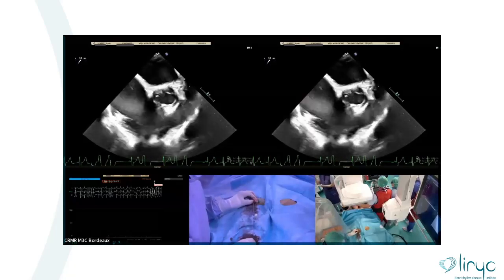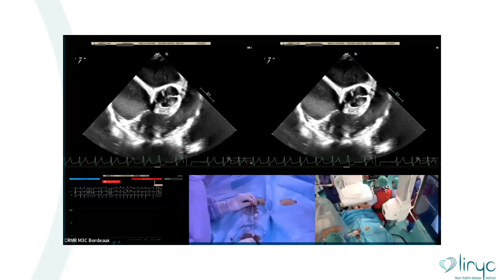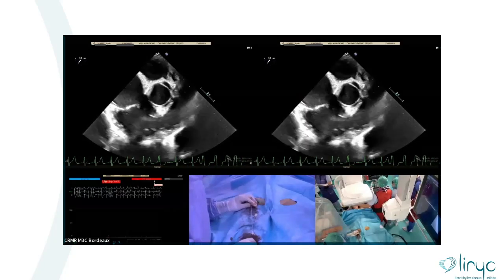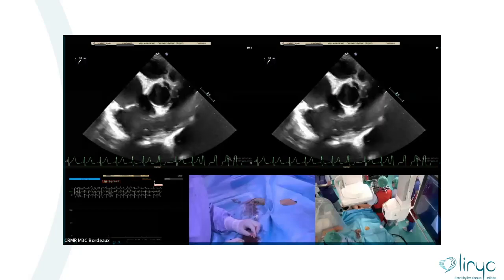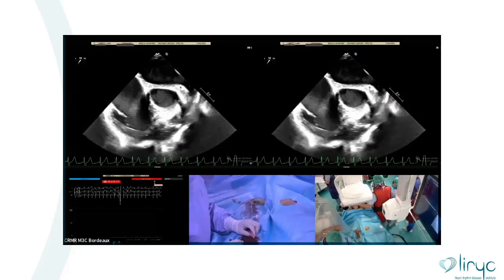Yeah, advance more, advance the catheter, and then we change to the, okay, stop there. That's enough. So the catheter is passed. Okay, we change the wire, another exchange wire. Yeah, change another wire, because it's too short.